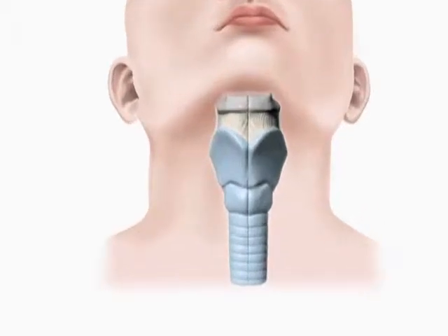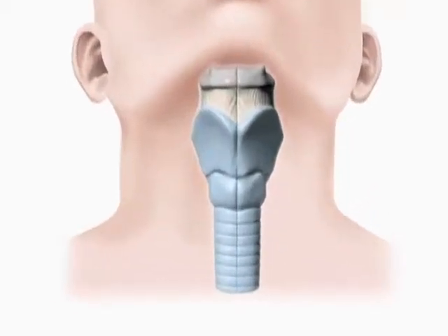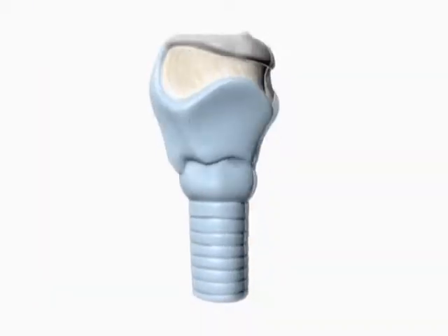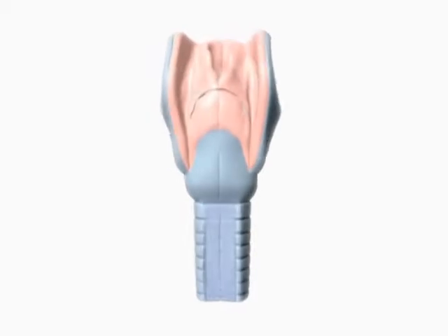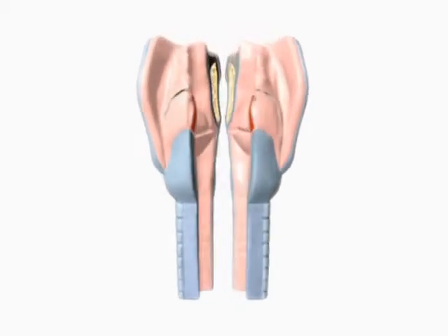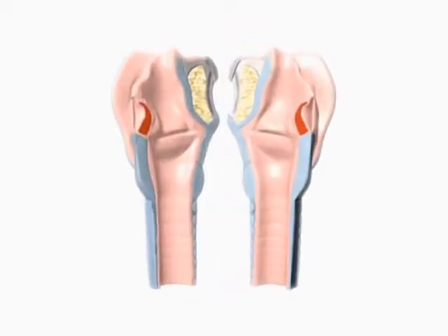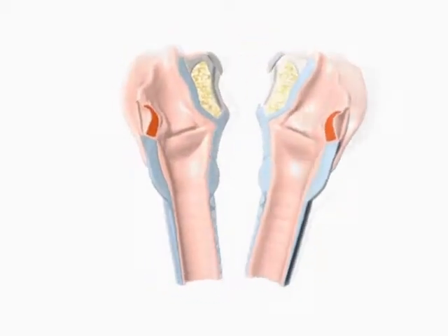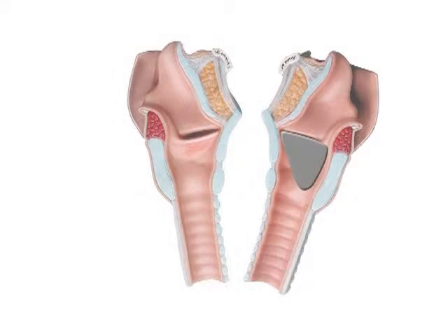Tumor resection will be illustrated in a patient with a T3 glottic cancer. The tumor is visible on the right vocal fold and it shows subglottic extension.